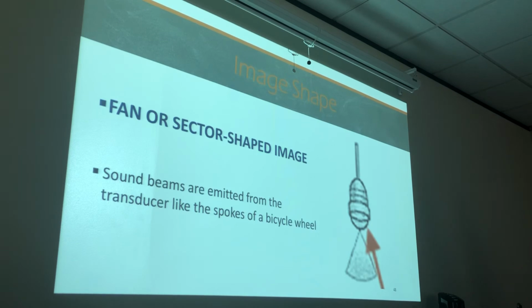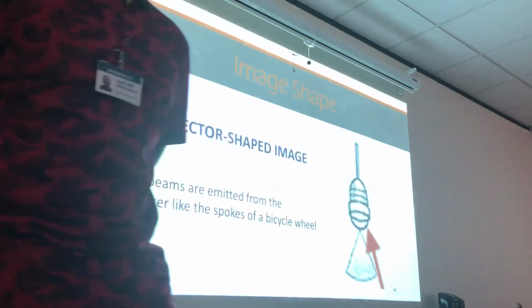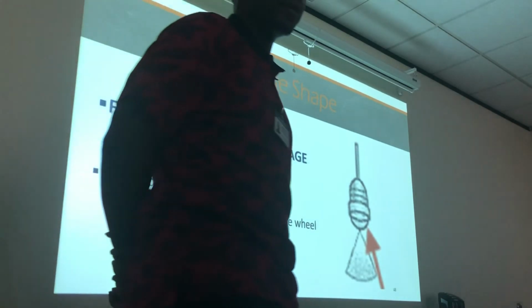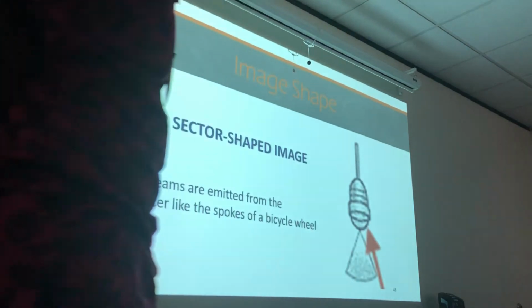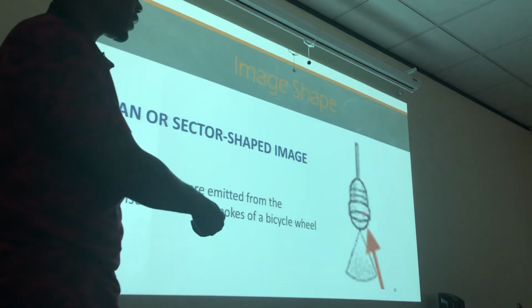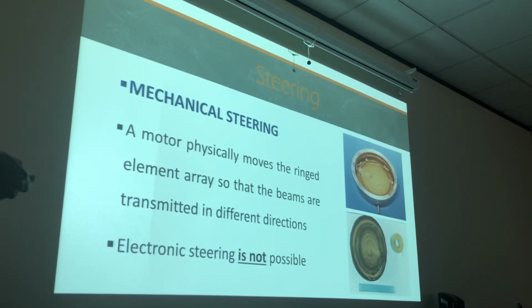Okay, it creates a fan or sector-shaped image, guys. Everything we talked about, guys, has created fan or sector-shaped images, right? Whether it be the mechanical transducer, the linear phased array transducer, or this one right here, the annular phased array transducer. The first three transducers we talked about all create sector-shaped images. All right? So that means sound beams are emitted from the transducer like spokes of a bicycle wheel, like a windshield wiper, right? Had that appearance just like this. All right?